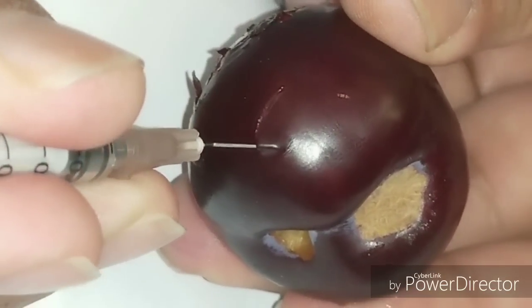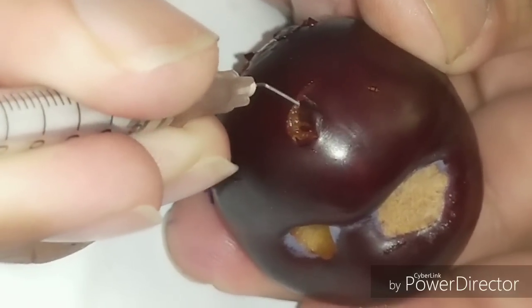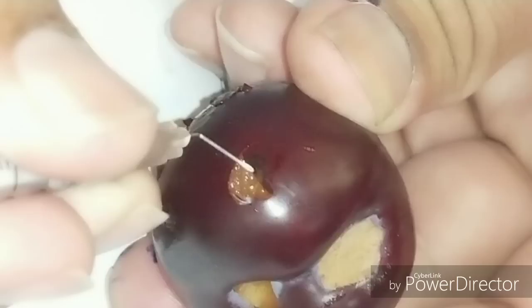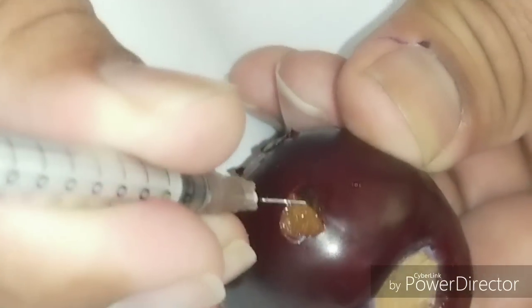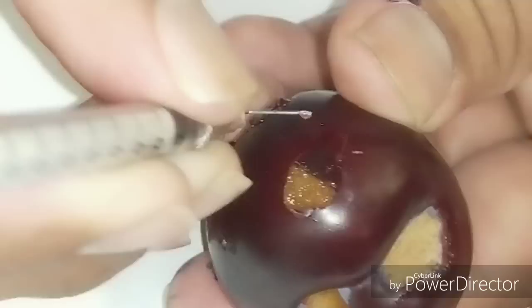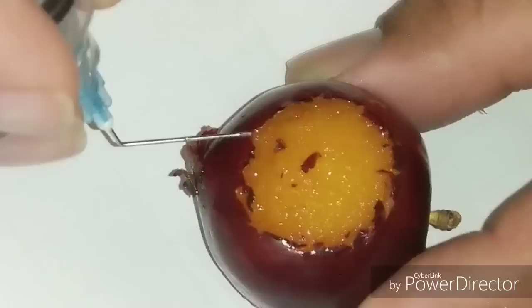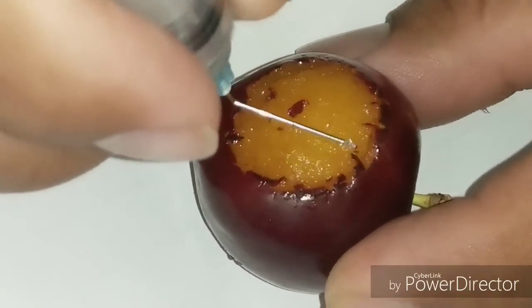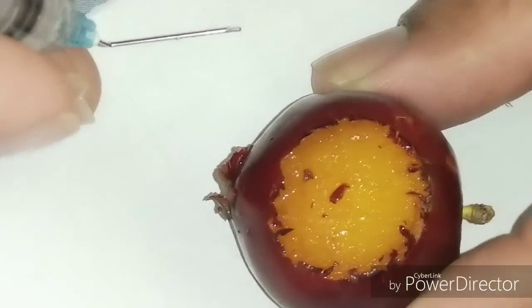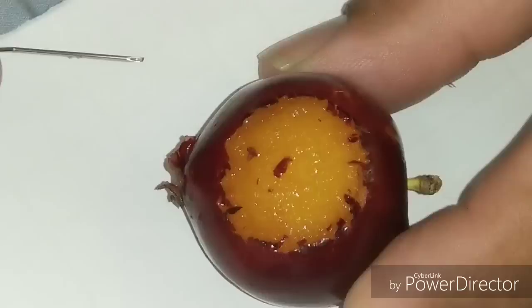For capsulorhexis on the plum, give a horizontal incision and then evert the flap. If you can make a flap, it is easy to move it 360 degrees to complete the capsulorhexis. The formation of this flap is the most important step. You can see the ragged margins with multiple tears in anterior capsulotomy.